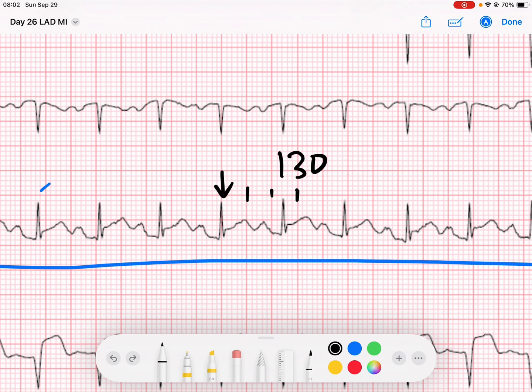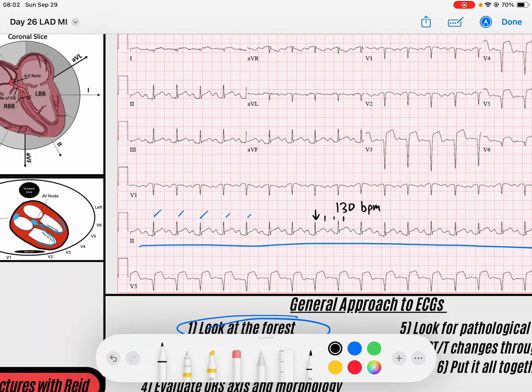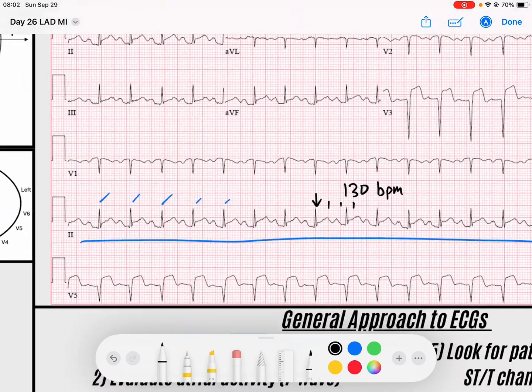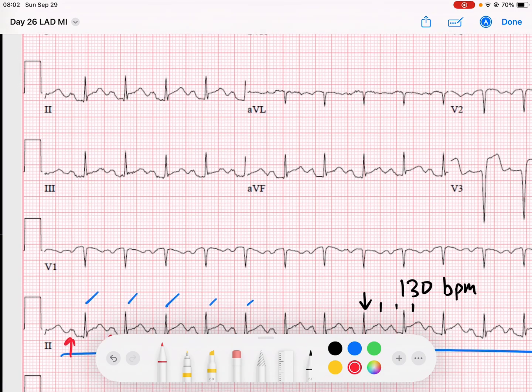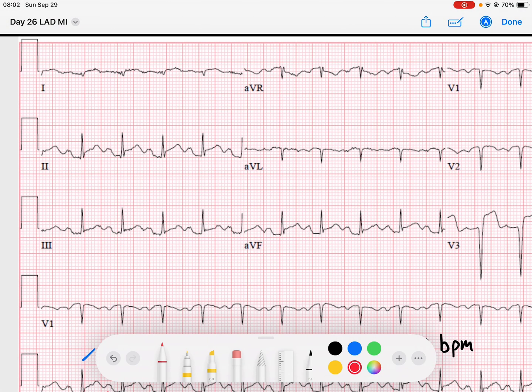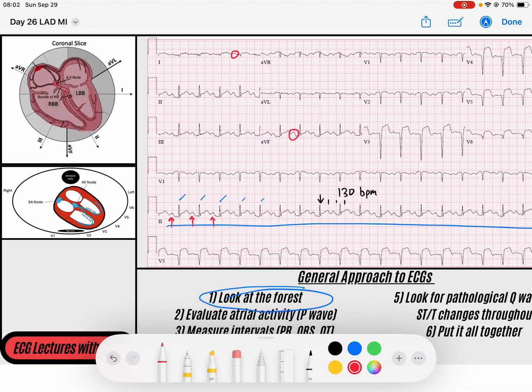So 130 beats per minute — we've got a tachycardic rhythm here because it's greater than 100. I want to make sure it's a sinus tachycardia, not some type of supraventricular arrhythmia. I see P waves in front of all of my QRS complexes, and those P waves seem to be upright in lead I and upright in AVF, which tells me they're going down and to the left — likely coming from the sinus node. So we've got a sinus tachycardia.